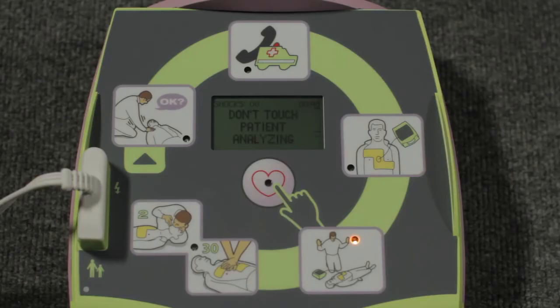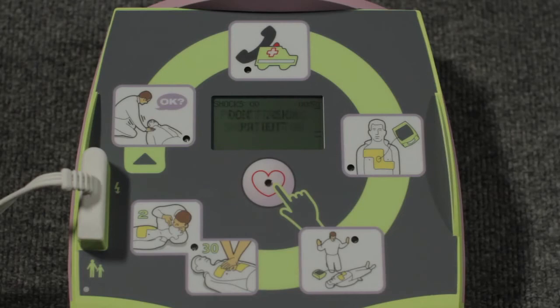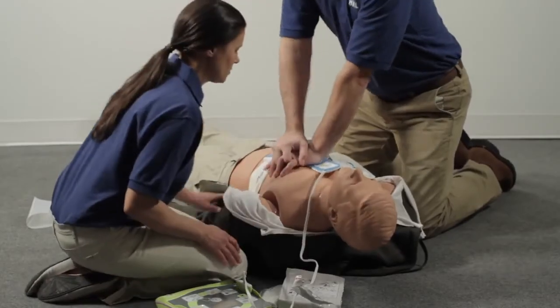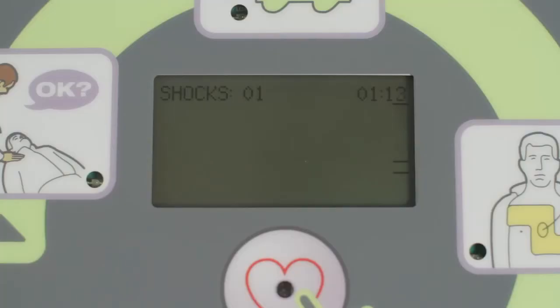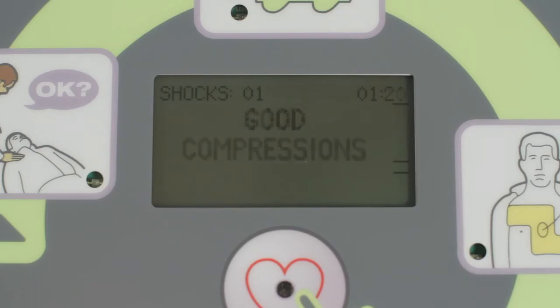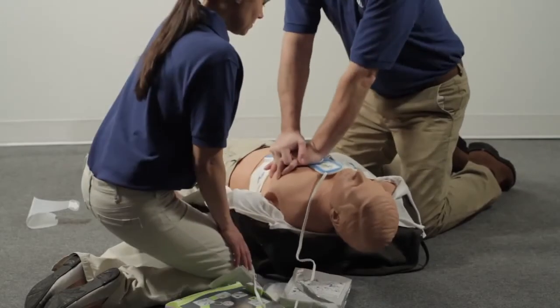Don't touch the person while the AED is analyzing the heart. If a shock is advised, be sure that no one is touching the person — everyone clear? After the shock, immediately put your hands on the CPR landmark and begin CPR for two minutes: pump the chest 30 times and give two breaths. If your compressions fall short of two inches, the AED will let you know every 15 seconds. When your compressions become deeper than two inches, the AED will again let you know with feedback such as "Push harder" or "Good compression."